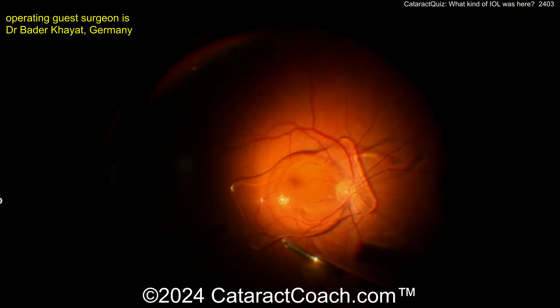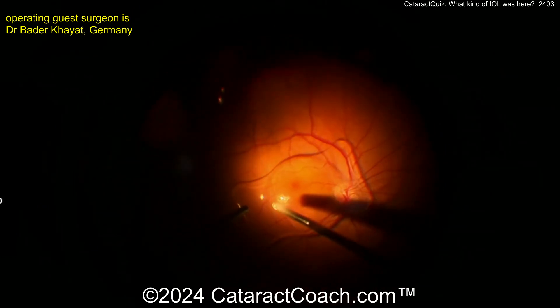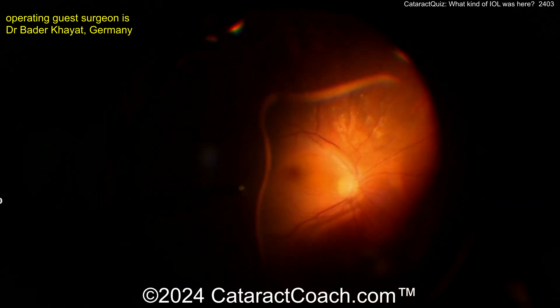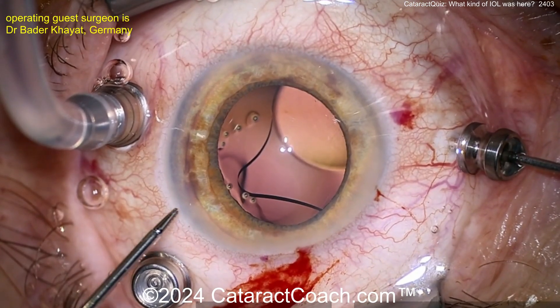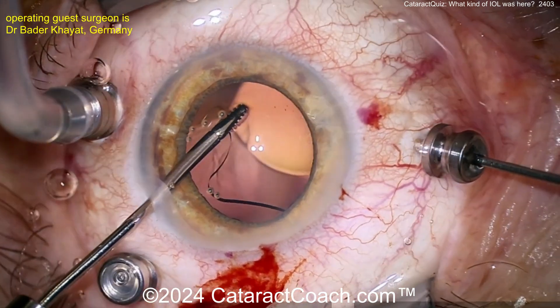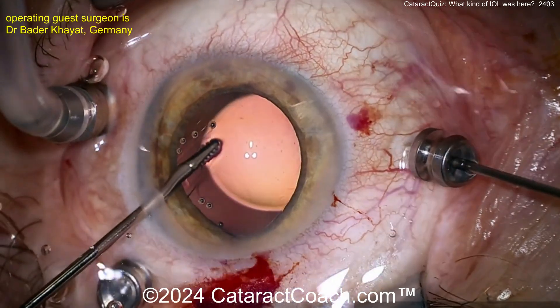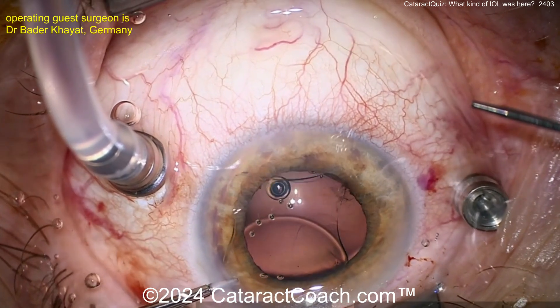Now looking here in the back of the eye — there is the lens. That's a plate haptic lens, typically made of silicone, at least here in the USA. That lens was placed in the capsular bag. In fact, the very first toric IOLs we had in the USA were made of this style — the plate haptic lenses. Now the surgeon is bringing the lens up toward the anterior segment of the eye, grabbing it with forceps. Remember, if it's a silicone lens, it can be very, very slippery — especially if coated in viscoelastic.